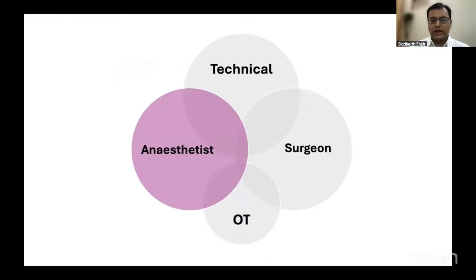Now, as soon as you've had an alert, or throughout the surgery, as Nikita and Parichar madam have already covered in detail, a big factor of what we monitor depends on how the anesthesia is. So the first thing we go through is a check on the anesthetic side. Speak to the anesthetist, see how the patient is. I turn around, I have a monitor which is always facing me, so I'm keeping a watch on the mean arterial pressure.